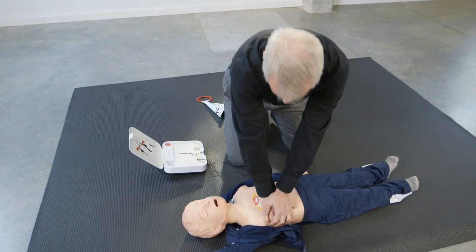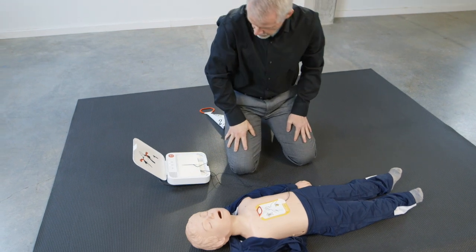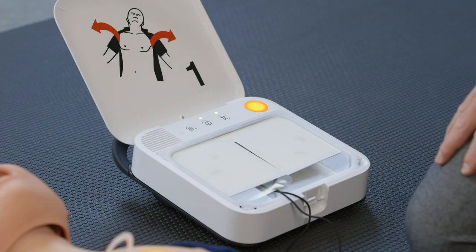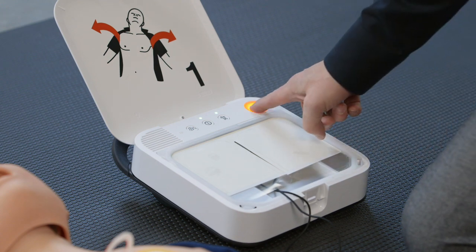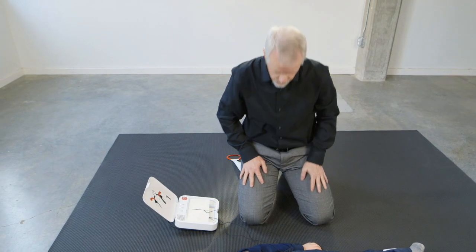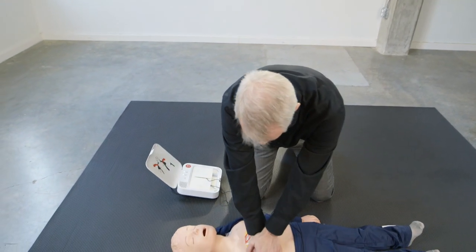Stop chest compressions. Everyone clear. Press flashing button. Shock delivered. Resume chest compressions. Push down deep.